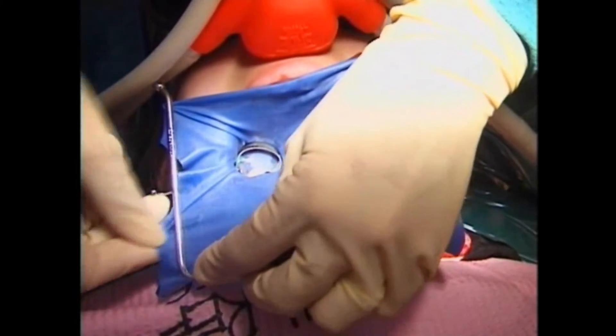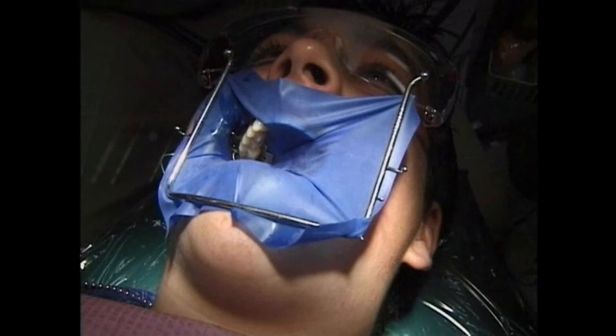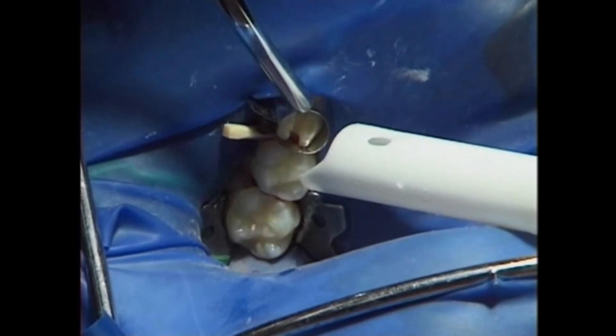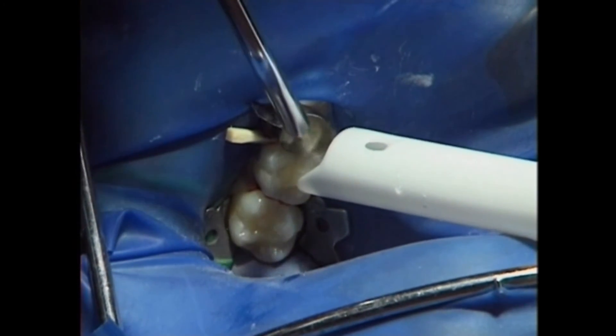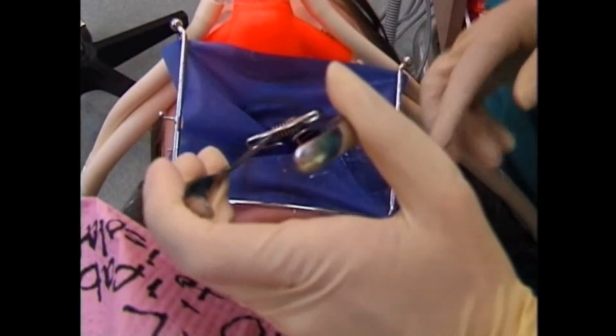We attach a special frame to hold the rubber dam tight and out of our way. Once the rubber dam is in place, it keeps your tooth dry and keeps anything from falling to the back of your throat. It keeps you more comfortable and lets us do a better job. When we're done, off it comes.